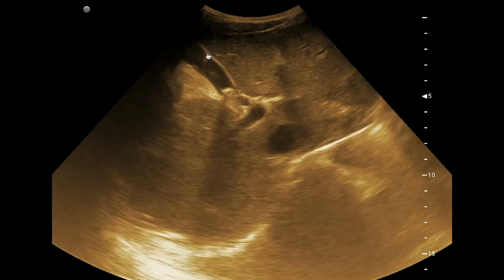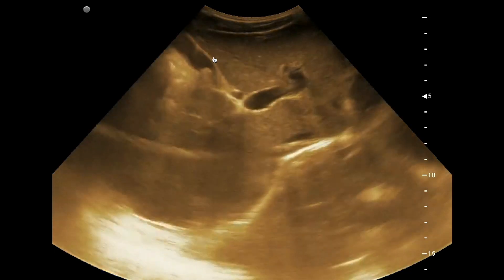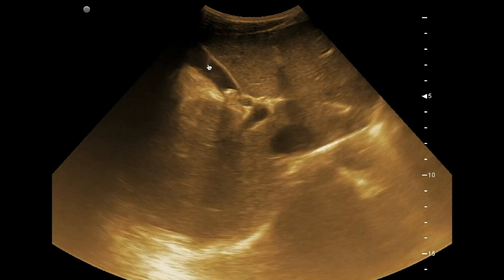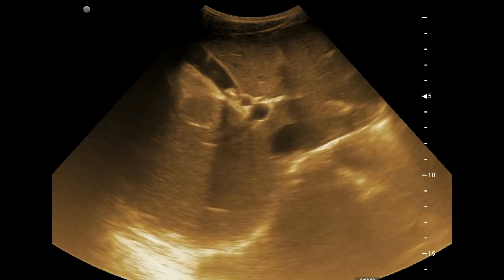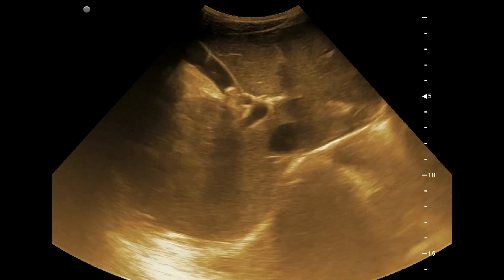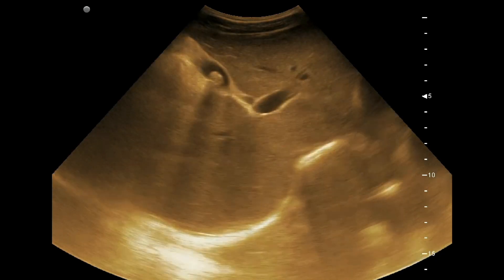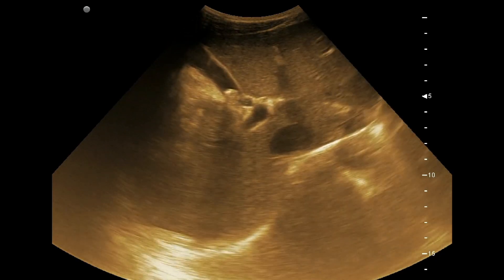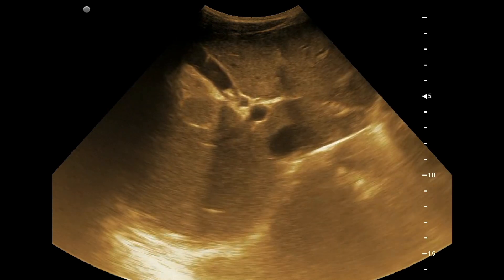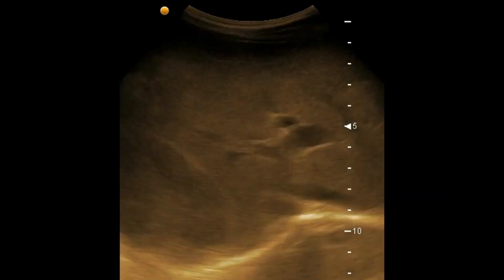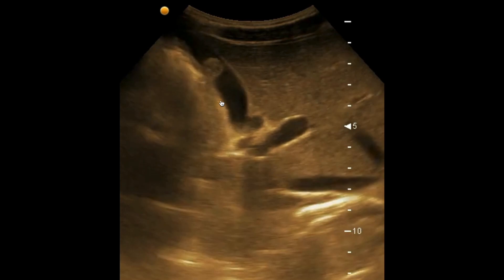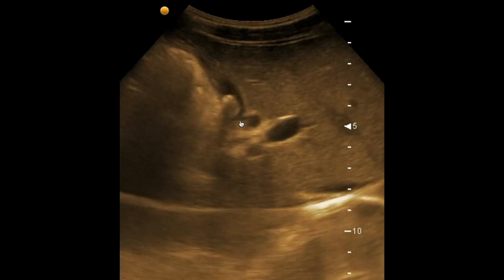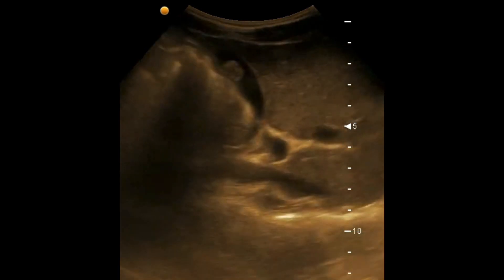If you look here carefully, you can see a comet tail artifact casting from the gallbladder wall, indicating it as a case of adenomyomatosis also. Here's another picture and you can see the stone is moving right now. It's coming from the fundus to the neck of the gallbladder due to the change of posture.